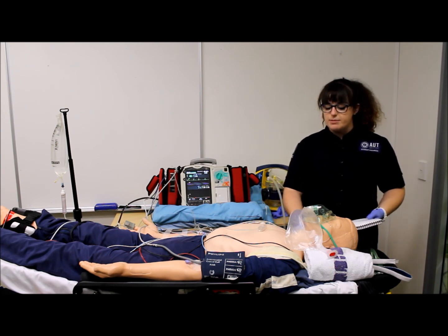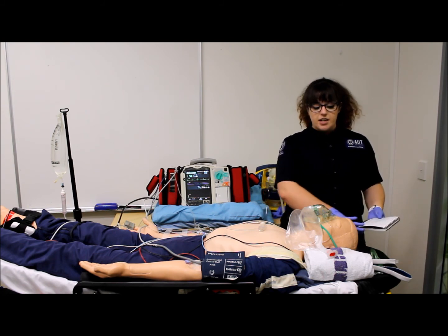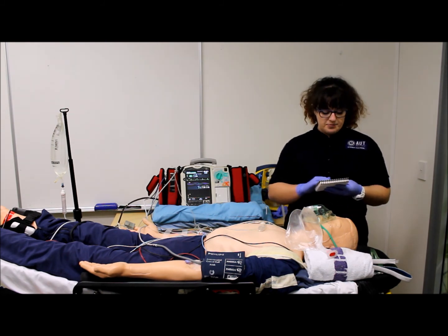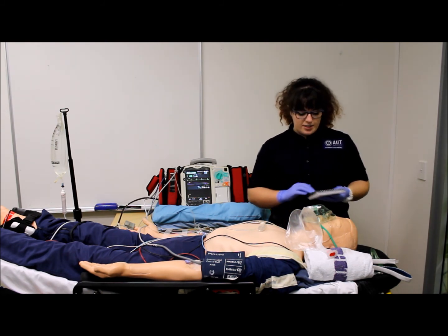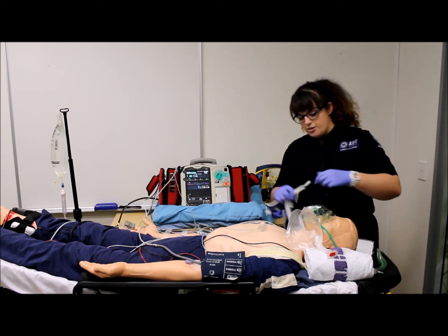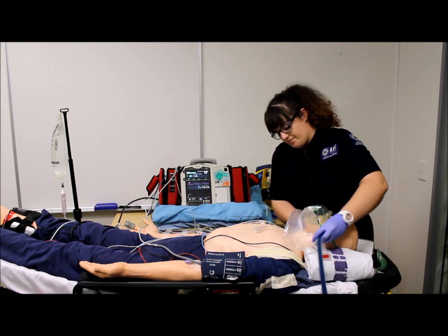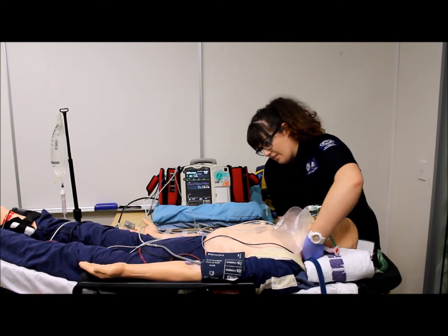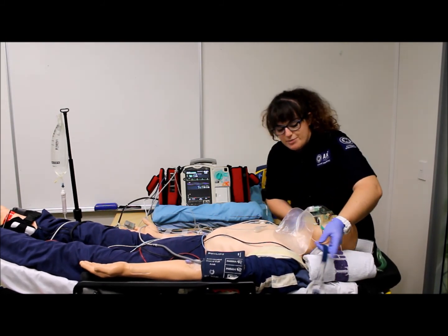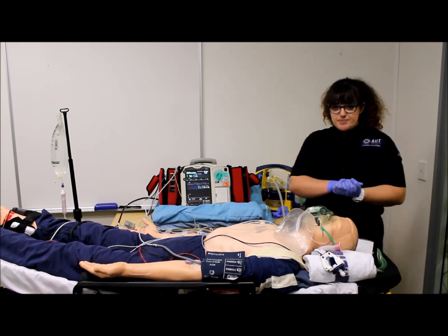We currently have our patient positioned as well as we can do in the sniffing position, as well as securing either side for query C-spine. We then have our ETT tube holder, which I'm now just going to place underneath the patient's neck, without trying to move them as much as possible. So that's ready for when our ICP backup gets here.